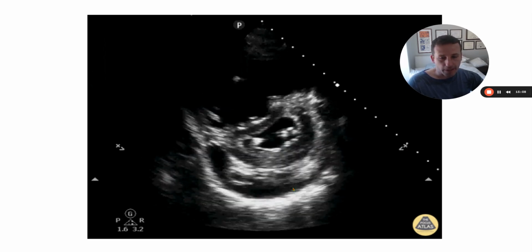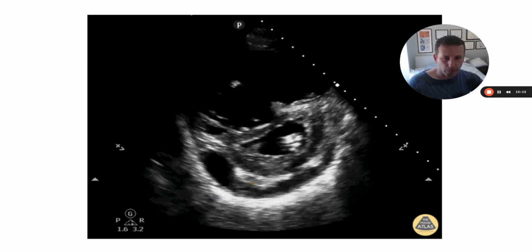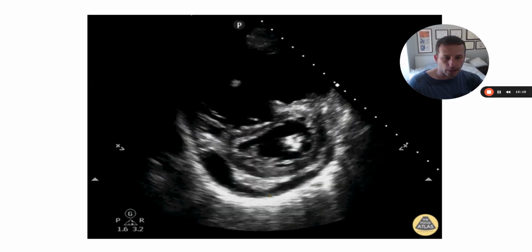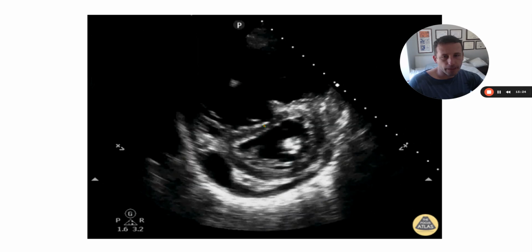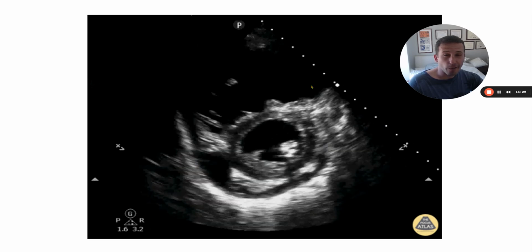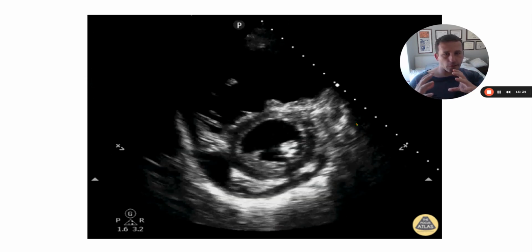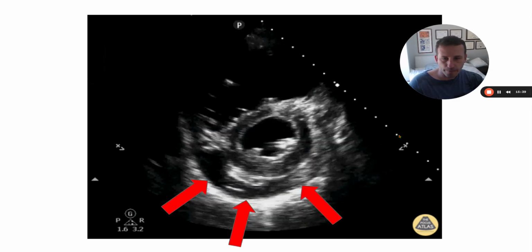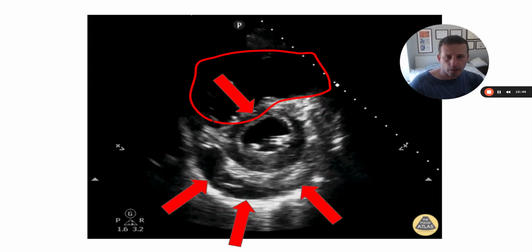Here, we've got a few things going on. So effusion here in the back, this is what a pericardial effusion is going to look like on a parasternal short axis. Just like with the long axis, you have that LV wall and then an anechoic signature here, and then your pericardium in the background. Notice the septum is bowing quite a bit. So this is indicative of high right-sided pressures, and the RV is actually like huge, ginormous. It has completely sort of outgrown that space that it usually occupies between 9 and 12 o'clock, and our LV is feeling the strain. So there's our effusion. We've got bowing of that septum, and then the RV is ginormous.